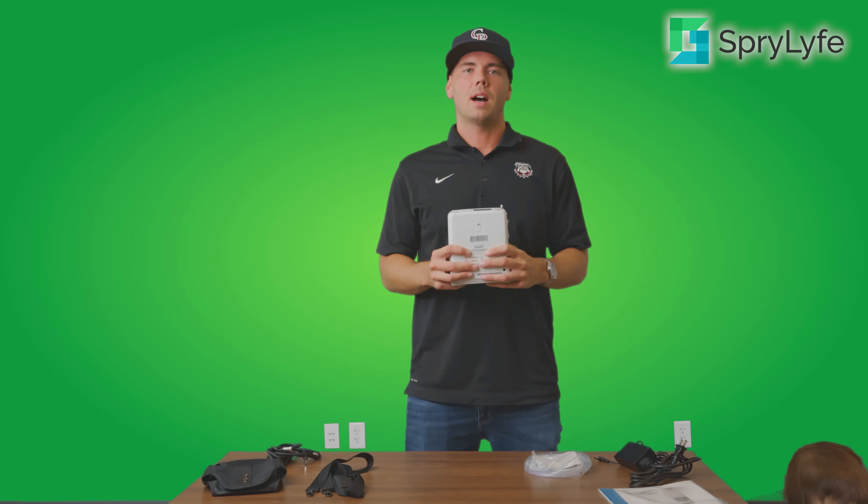The Inogen 1 G4 is a fantastic option for anyone who meets the flow setting requirement of one to three and is looking for a super lightweight, easy-to-use portable oxygen concentrator that you can take out with you. Just put it over your shoulder with the included carry case, go run some errands, head back home — it makes it much easier than carrying around a heavy oxygen tank.